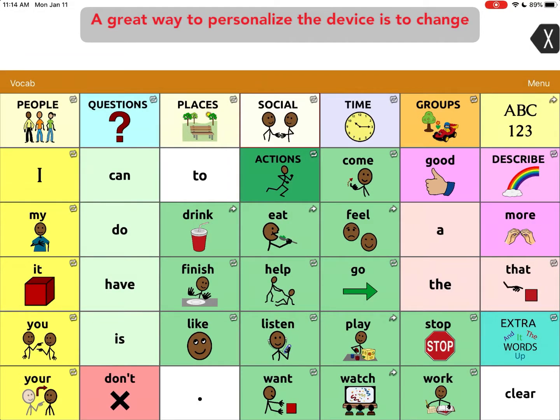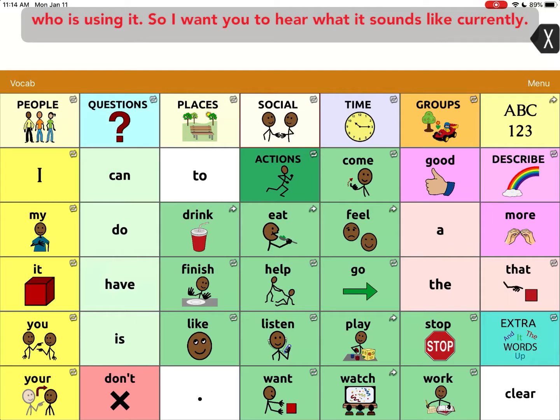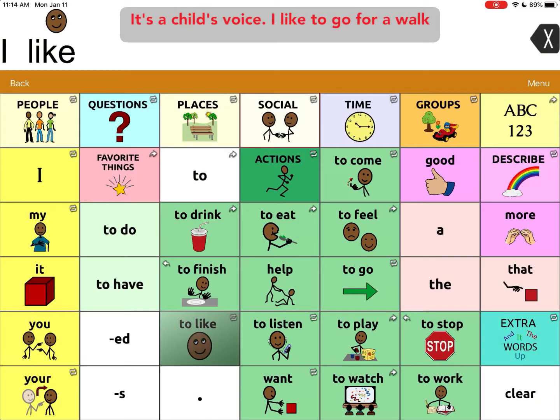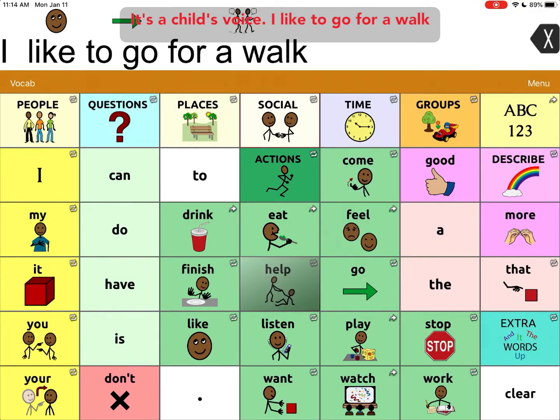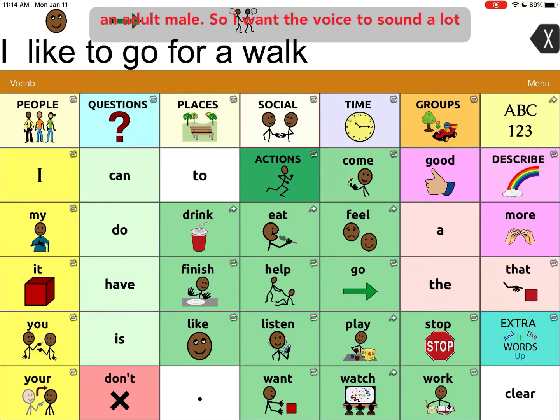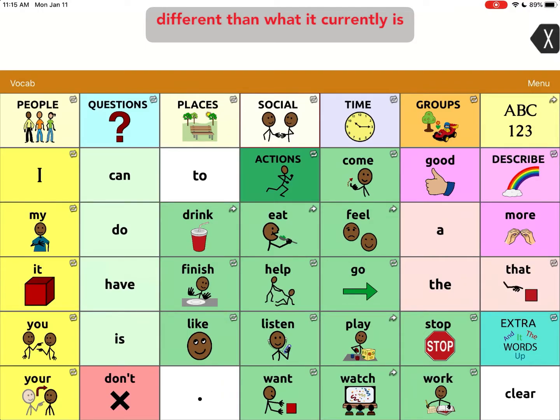A great way to personalize the device is to change the voice to make it sound more like the person who is using it. So I want you to hear what it sounds like currently — it's a child's voice. 'I like to go for a walk.' But let's say my user is an adult male, so I want the voice to sound a lot different than what it currently is.